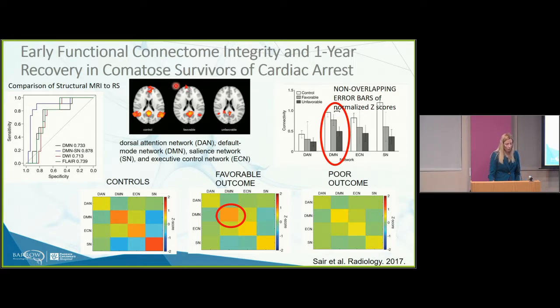So we're fortunate at our institution that we have experience in individually interpreting children who've had, for the most part, a prior brain injury and went on to have intractable epilepsy or from disorders of consciousness directly during the time of their acute brain injury, experience in interpreting individual resting state functional MRI in children over the entire spectrum of neurodevelopment. And at no point in time did we have divergent data in which networks were not detected unexpectedly or vice versa. And so we have a comfort level in interpreting these tests in all ages at our institution.